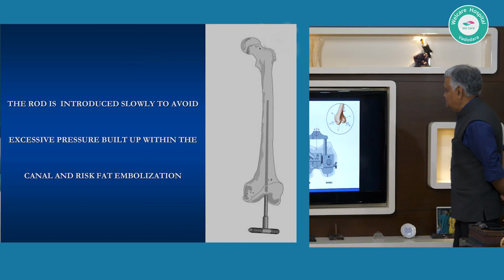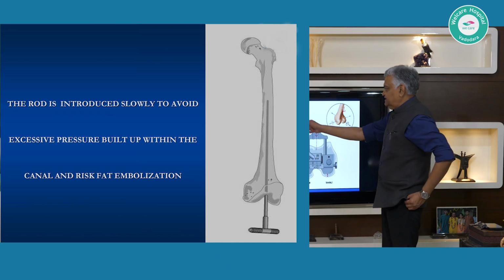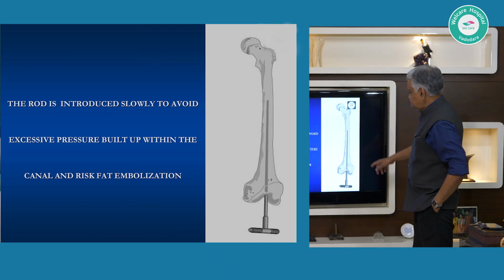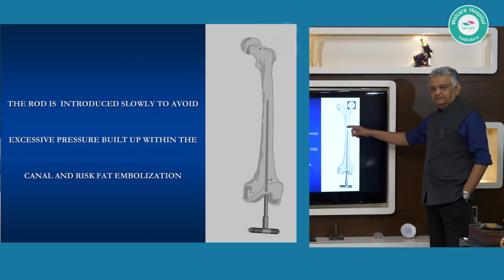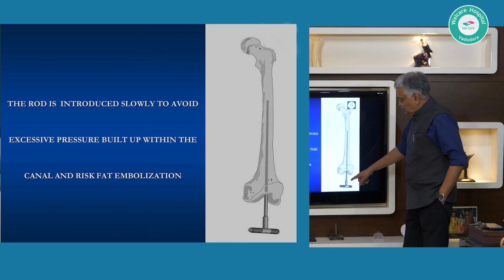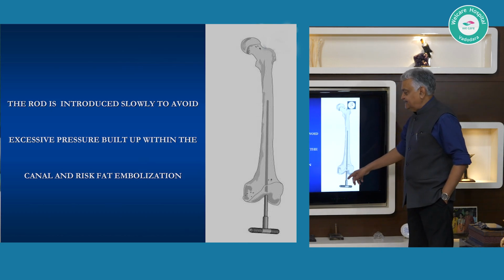Yeah, good. So here we come to the femur, go back one. Now you have done the drill hole and you have pushed your intramedullary rod in. Once you push it in, you remove this T handle.